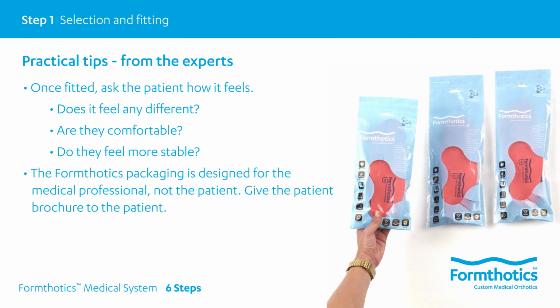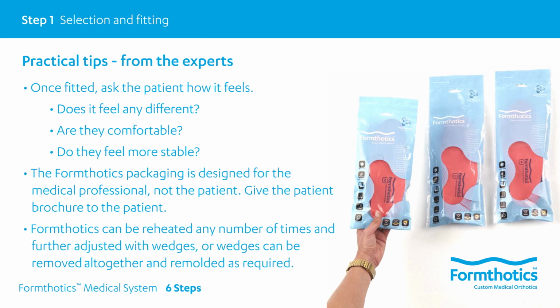The Formthotics packaging is designed for the medical professional, not the patient, though if they must bring their old shoe liners home, the bag can be used to store these in. There is a small patient brochure in the packaging that can be given to the patient to review. And Formthotics can be reheated any number of times and further adjusted with wedges, or wedges can be removed altogether and the orthoses remolded as required.